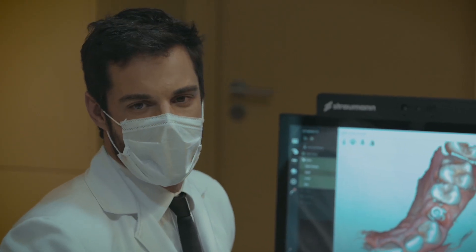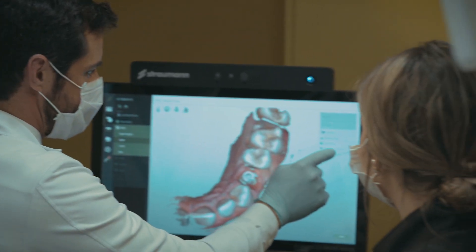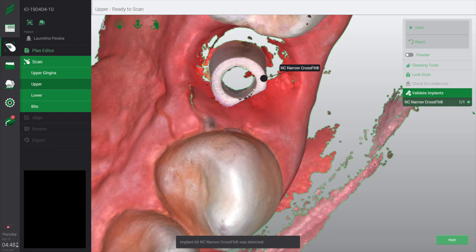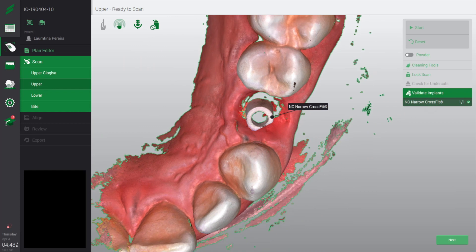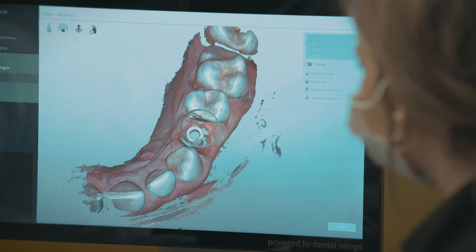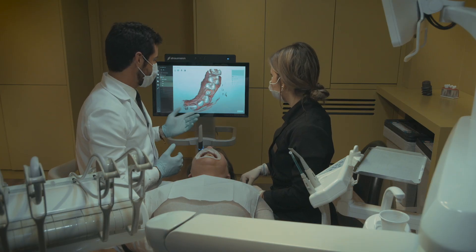Now it's time to validate our implant. We go to the tool and you can see that we selected the NC on the scan body — narrow platform. Then we go to the next step. And because we have an auto-cleaning tool, the artifacts like the tongue and the lips will disappear automatically.